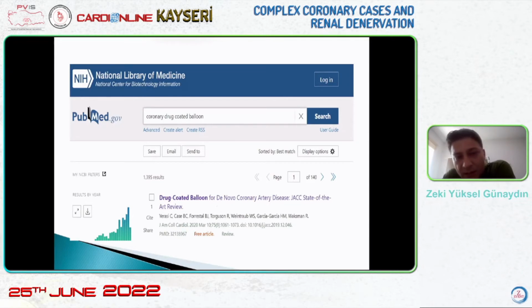As a country, we do not use it much. In our clinic, we only had 20, and we used them. We couldn't follow up patients for a long time.